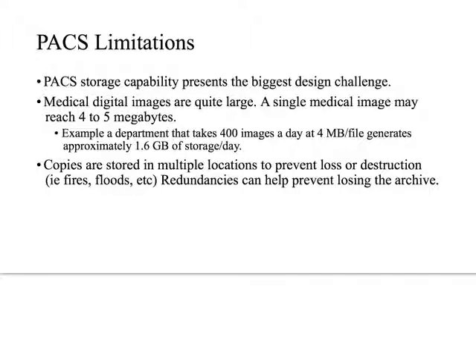We have to find ways to manage that generation of data. I mean, that's every hospital in Memphis creating that kind of data. When you think about it at a global scale, this is what people are talking about when they're talking about big data. And finding not only ways to store it, but also ways to harness the value of that data, like we mentioned earlier, all this stuff that's embedded in DICOM headers, that's really where we're at. That is the state of the art. And there's a lot of limitations to why we don't master all of that.